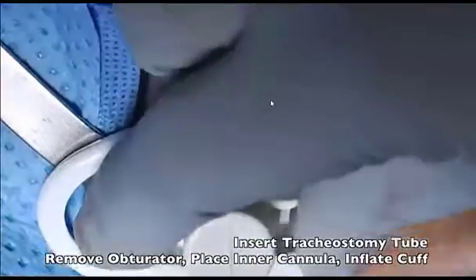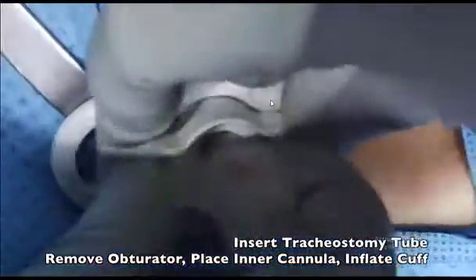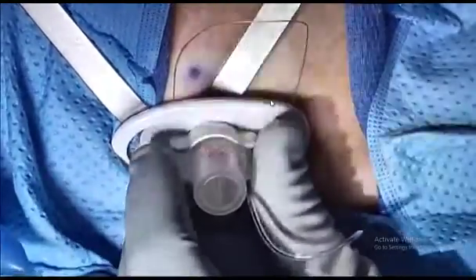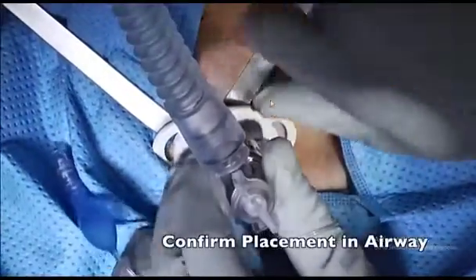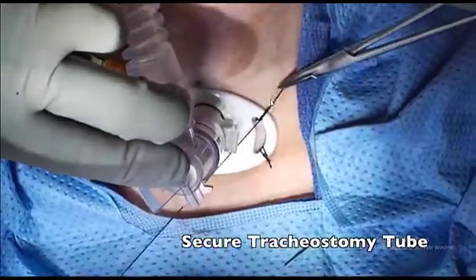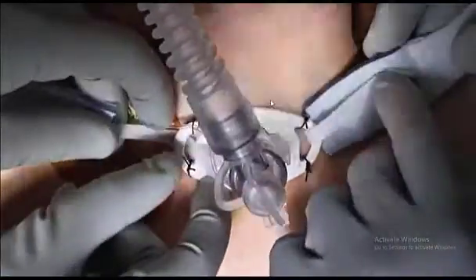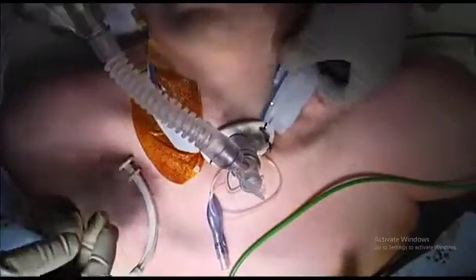Then, once ready, we will now insert the tracheostomy tube. I forgot to mention about the obturator. Maybe I'll just explain it to you guys next week, since babalikan pa naman natin to for the tracheostomy care. Now, once the trach has been inserted, we will now connect the oxygen. Be sure to confirm the placement. And then last, the surgeon will secure the tracheostomy tube, what you call this one, the flange. And then strap it. This will secure the tracheostomy.